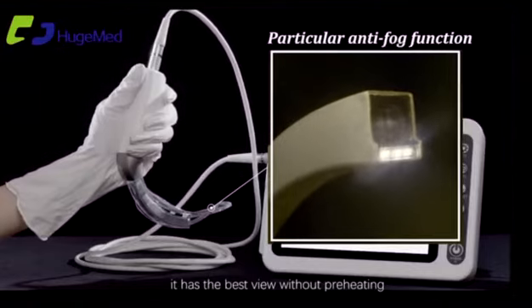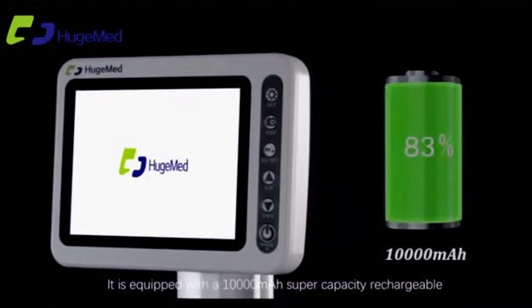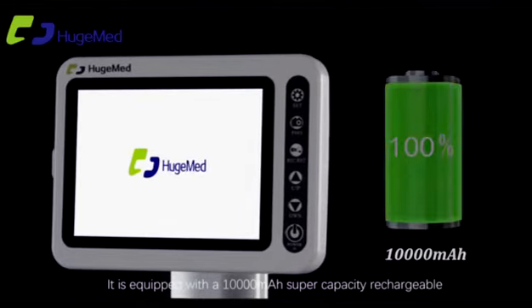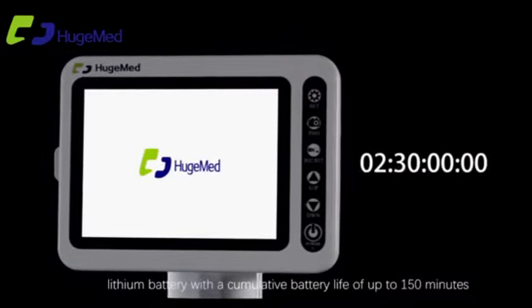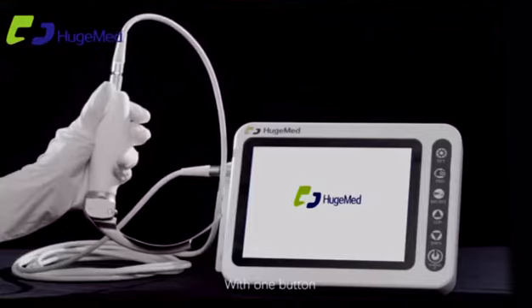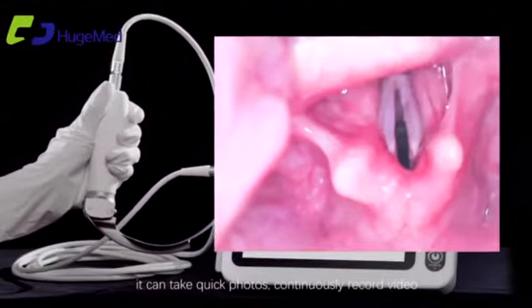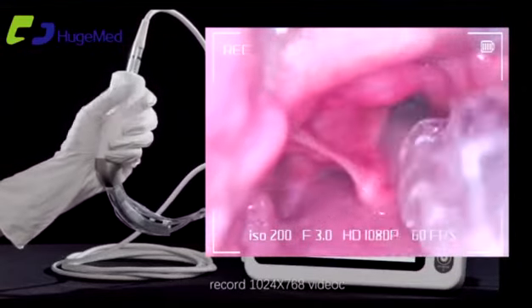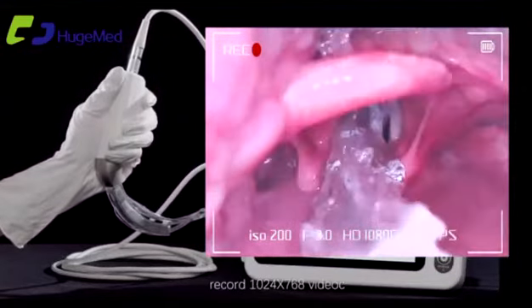With the anti-fog function, it provides the best view without preheating. It is equipped with a 10,000 mAh super-capacity rechargeable lithium battery with a cumulative battery life of up to 150 minutes. With one button, it can take quick photos, continuously record video, and record at 1024 by 768 resolution.